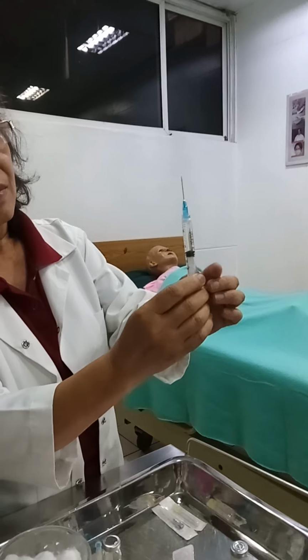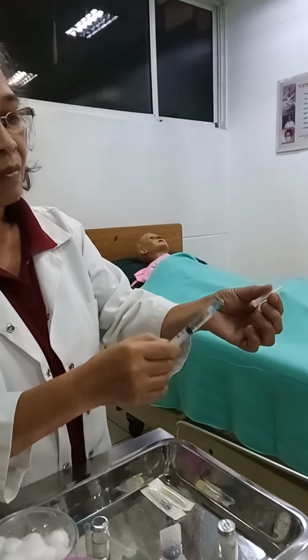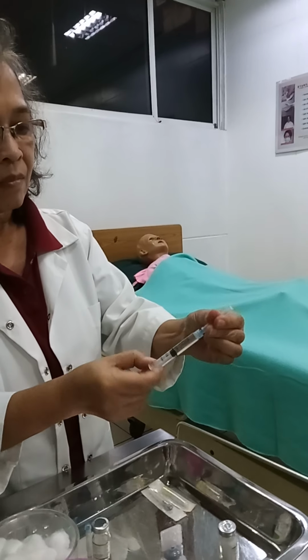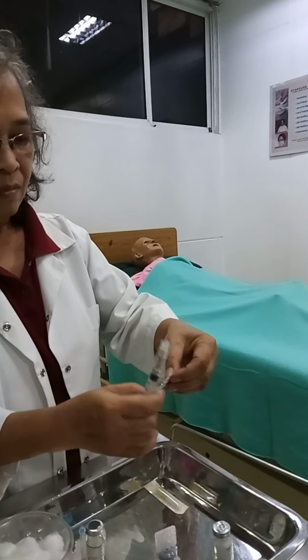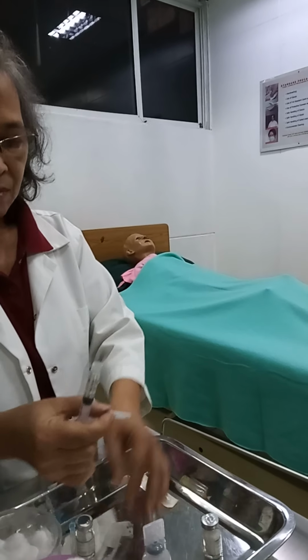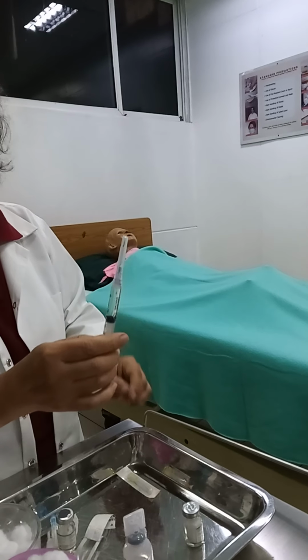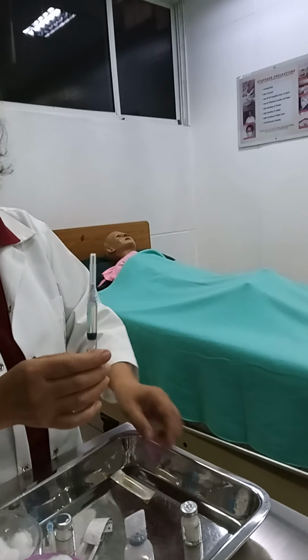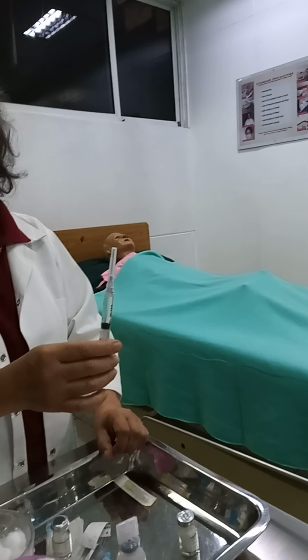If medication is to be injected into the client's tissues, change the needle to the appropriate gauge and length according to the route of medication. For a multi-dose vial, label with the date of opening, mixing if any, concentration per ml, and nurse's initial.